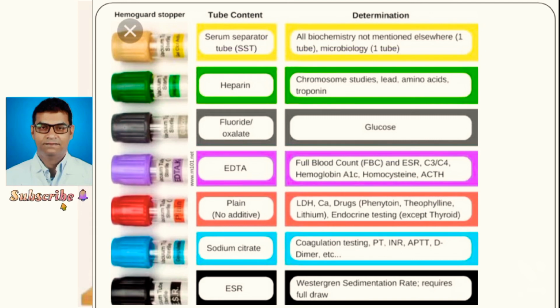The anticoagulants that are commonly used in the hematology laboratory have a universal color. EDTA used for routine hematology procedures is lavender. Sodium citrate, used for coagulation and platelet tests and also for ESR, will be blue. Heparin is used for osmotic fragility and spun hematocrit. It may be available in green and brown. Preparation of heparin: 0.4 grams of prepared heparin is dissolved in 100 ml of distilled water. 0.25 ml of this solution is added to each of a series of tubes and evaporated to dryness at 37 degrees centigrade.